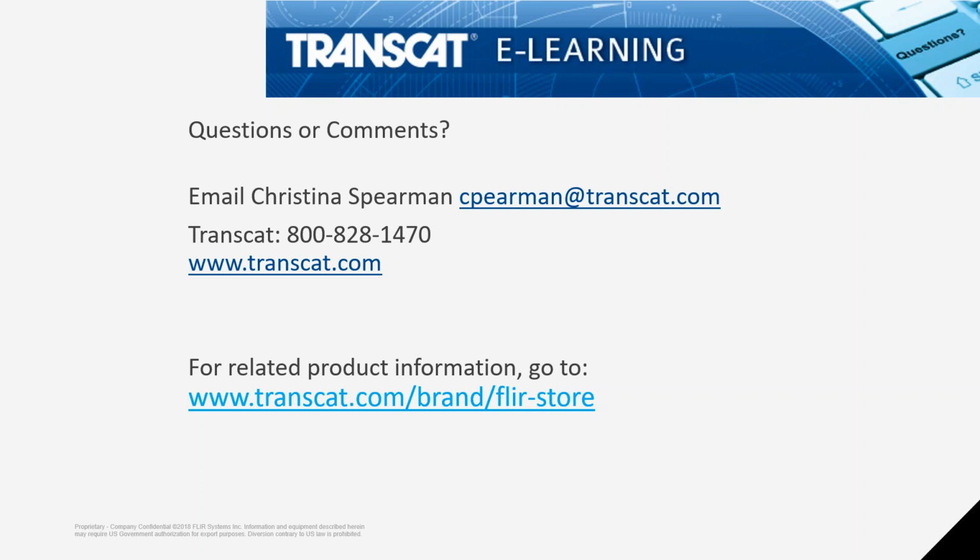With the new EST cameras that we have, those will do it automatically for you. Once a person is in that box, it'll automatically store that temperature. So that is a nice upgrade. It's an upgrade that you can get for your traditional predictive preventive maintenance camera, and it's something that comes standard with the new cameras that'll automatically take those temperature measurements for you. So, great question. Okay, the next one: is there a correlation between core body temperature and the EST readings?